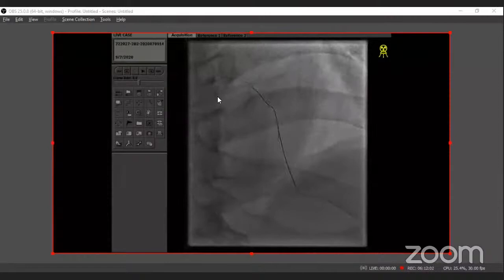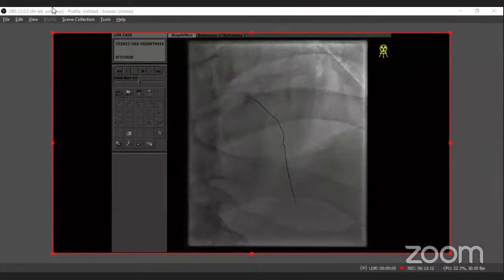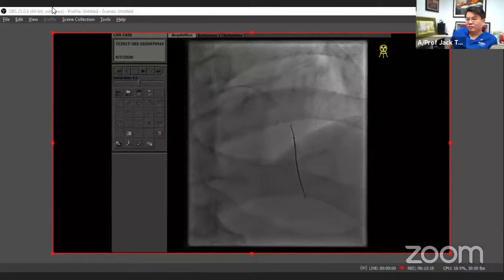Yep. So we may change to a new wire to facilitate wiring because we may have to wire this again later on. So you might also want to give, I know it's a bit uncomfortable for a patient for a long procedure, maybe sedation. Okay, this is the side branch. We're going to park it there.